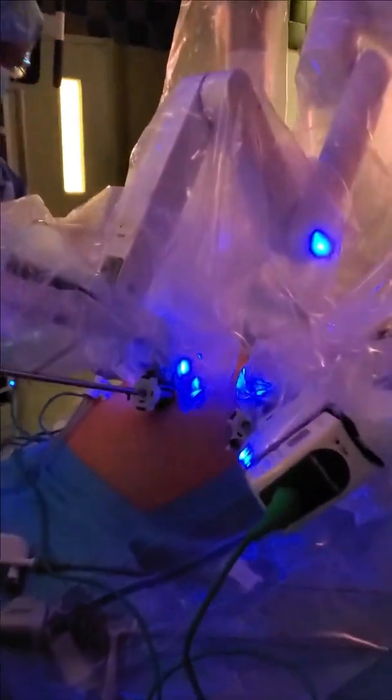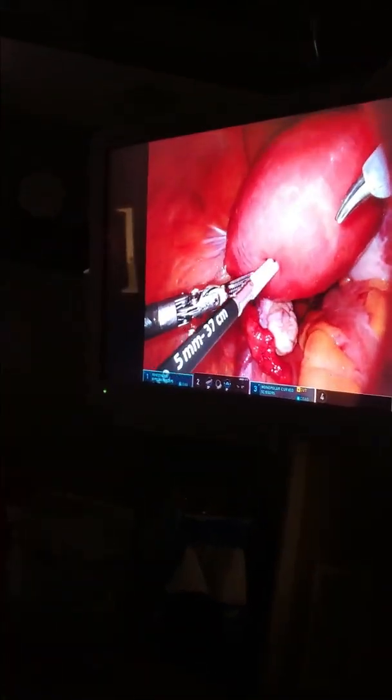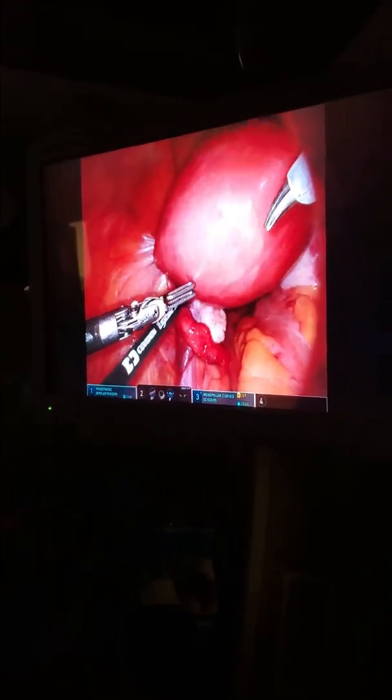Now the robot is attached — I'll show you guys what it looks like over here. Those are all the instruments. There's my lovely assistant and my other lovely assistant over there. We're gonna get started. You guys can see that's the uterus — my assistant is pushing up on the uterus, and those are the two robot arms.